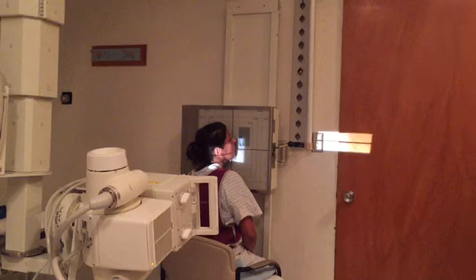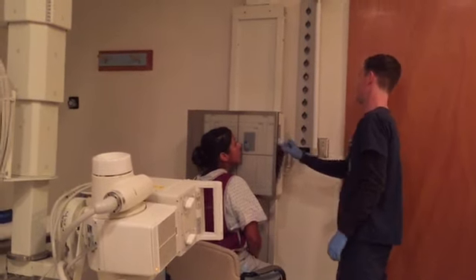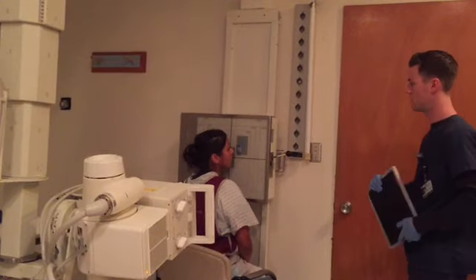Evelyn, hold your breath, don't move. Expose. Go ahead and breathe. Got my cassette, run it, and that is the mandible series.